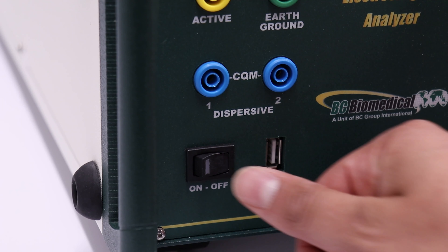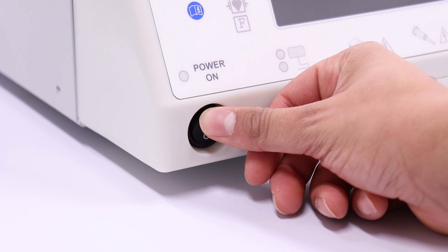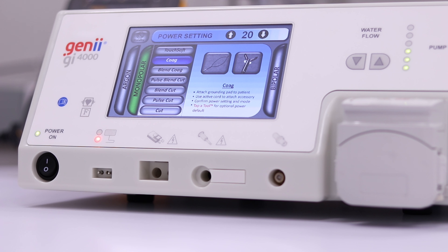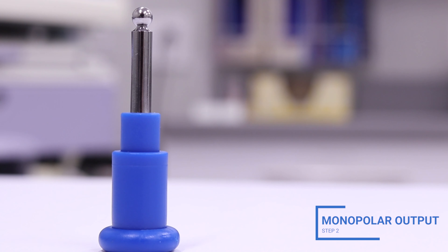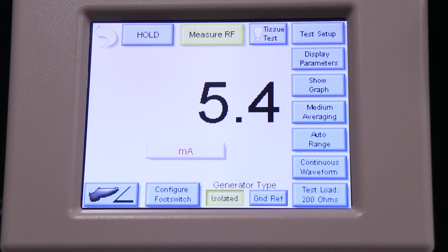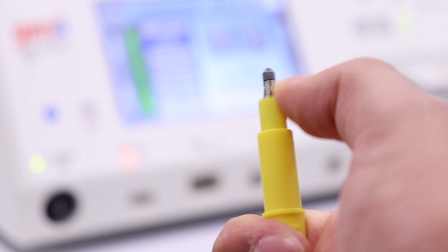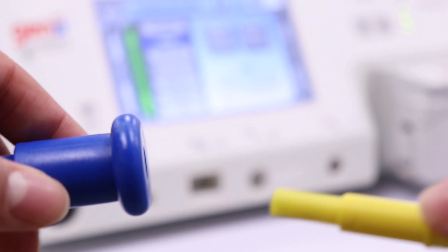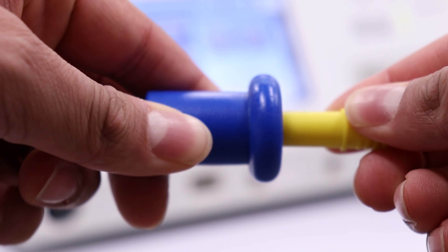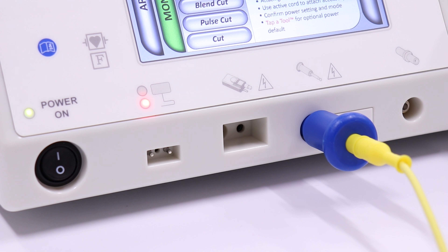Power on the analyzer. Power on the GI-4000. Select Measure RF Energy from the main menu of the analyzer. Connect the monopolar test adapter to the retractable end of the yellow active test lead, then connect the monopolar test adapter to the monopolar output receptacle on the GI-4000.